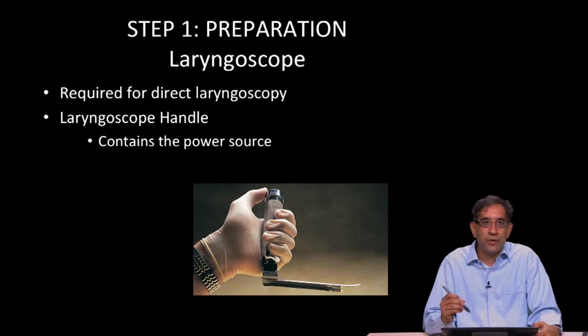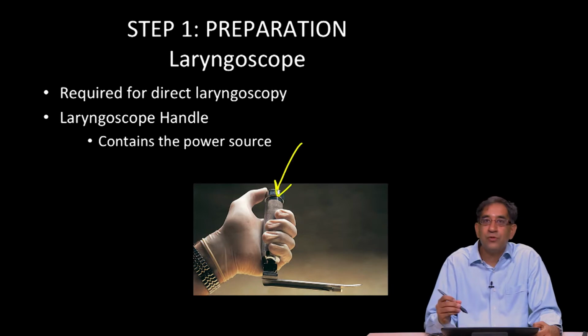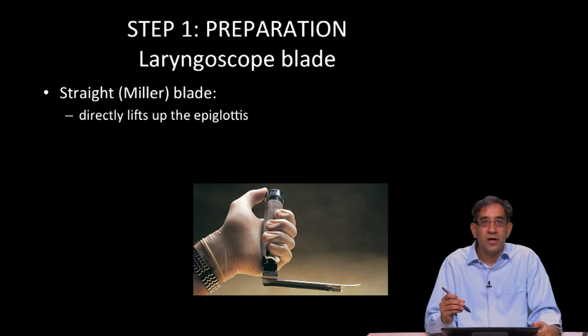You want to get your laryngoscope ready as well. If you're going to do direct laryngoscopy, which means looking directly at the vocal cords, you need to have a laryngoscope. You want to check the handle to make sure that the batteries are in there and they're working, because the last thing you want is for the batteries to run out while you're trying to perform this procedure. Then you want to have the right blades available.